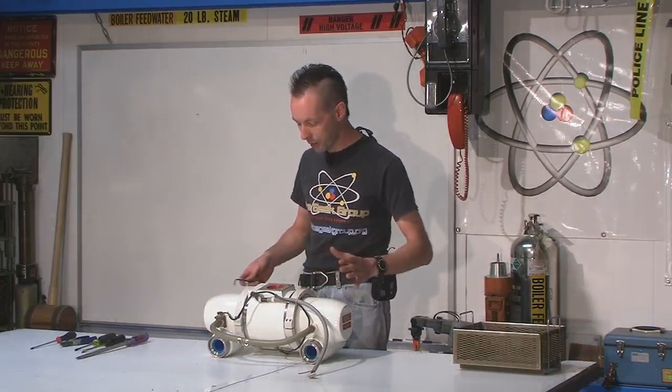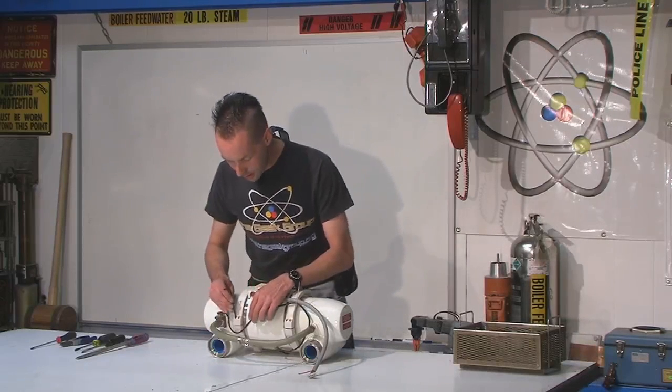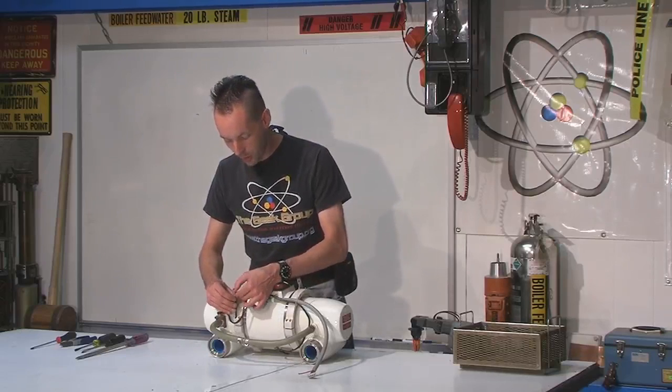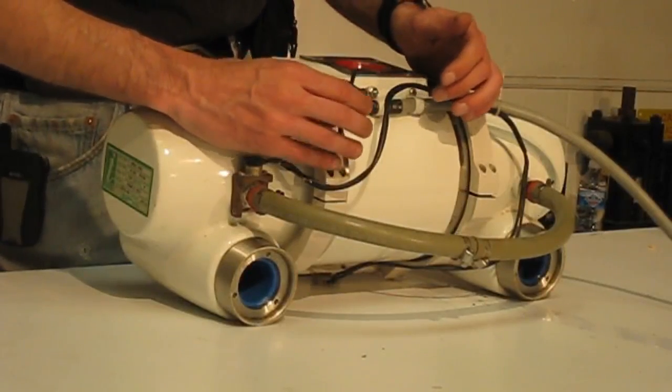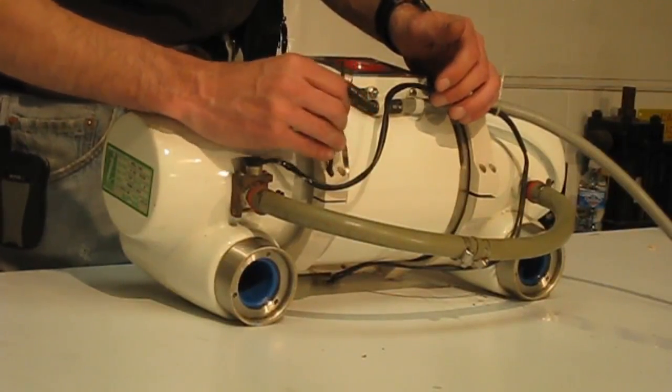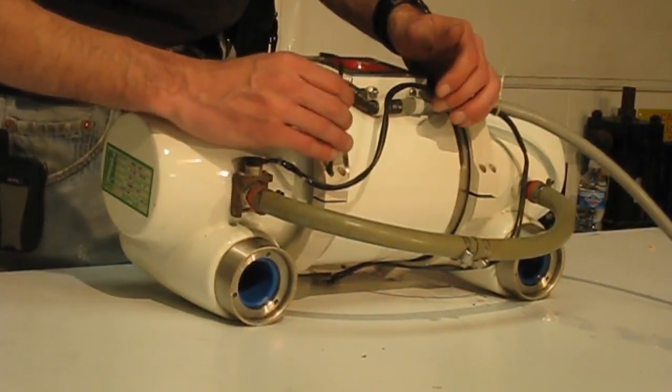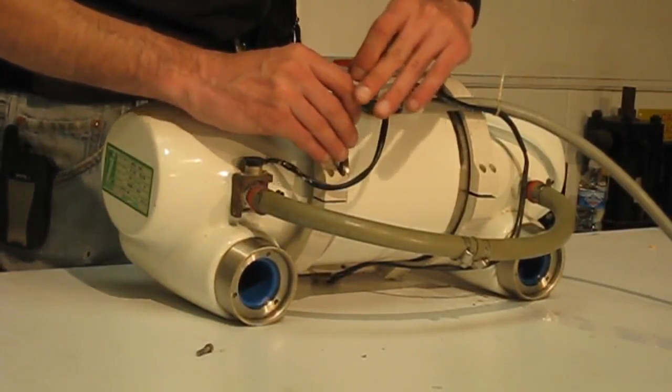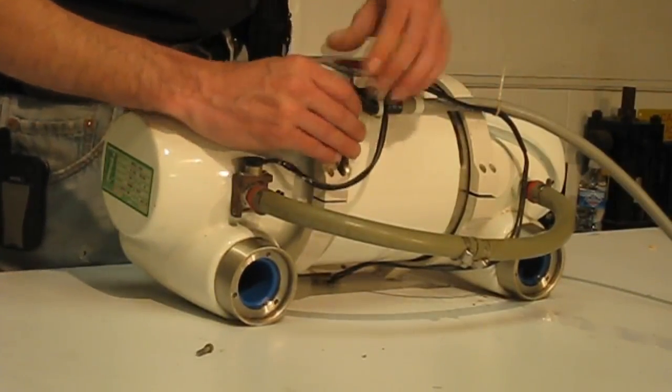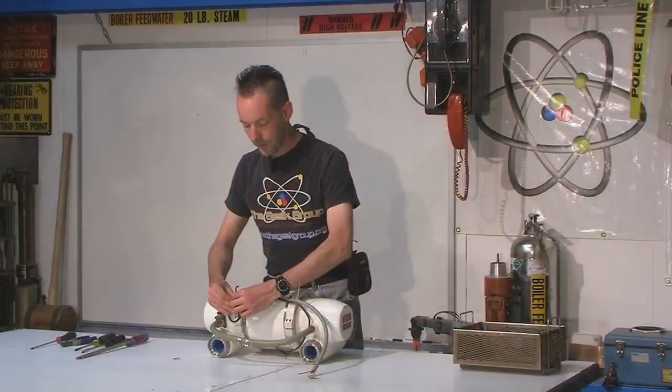But we're just going to start with some basic disassembly on the outside. And I've got these here which are recessed allen bolts. Which we're just going to pop right out. So nothing special on this. There's an allen bolt. I bet they don't all come that easy. Okay, maybe they will.